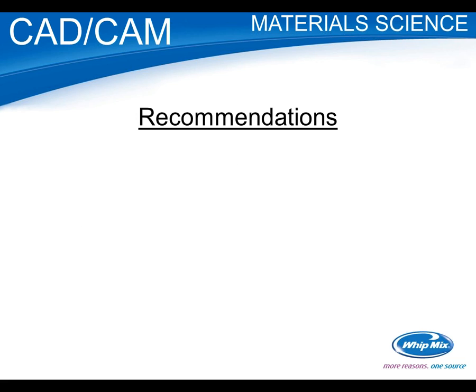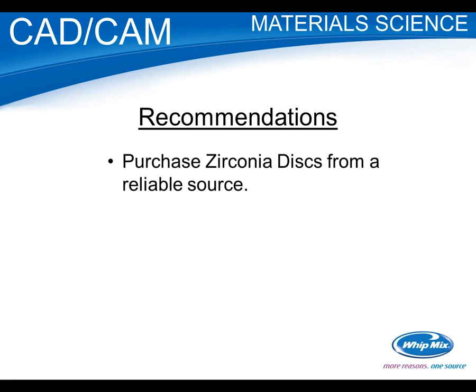So recommendations on zirconia is, again, purchase your disc from a reliable source. It's a significant investment. This is your consumable, and price is important, but quality's got to be number one. All right. And I think it's fair to question your supplier, and if your supplier doesn't have any idea really where they're made, what they're made of, how they're made, then you may want to talk to somebody else.